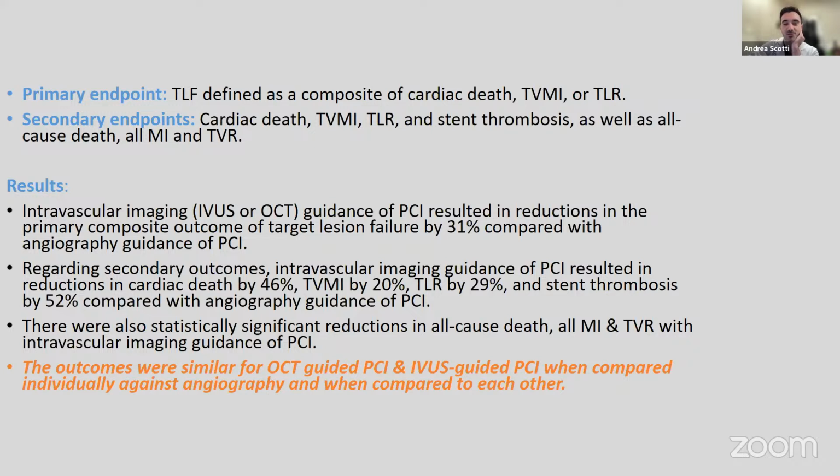Actually, I had a question for you now that you're finishing with all the evidence here in the literature. I wanted to ask for a quick comment on the PREVENT trial just presented and published at ACC. What's your take on this study? What about vulnerable plaques? How can we use imaging? And what do you think about this study?